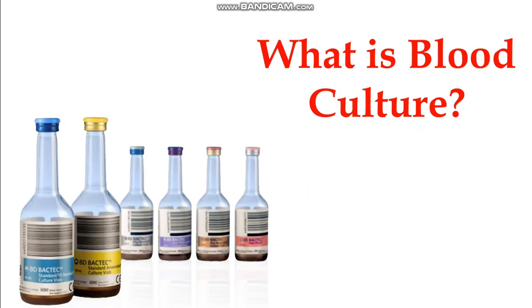So what exactly is blood culture? Blood culture is a test where we take a sample of a patient's blood and place it in special bottles with growth medium to see if any microorganisms grow. This tells us if bacteria or fungi are present in the bloodstream.